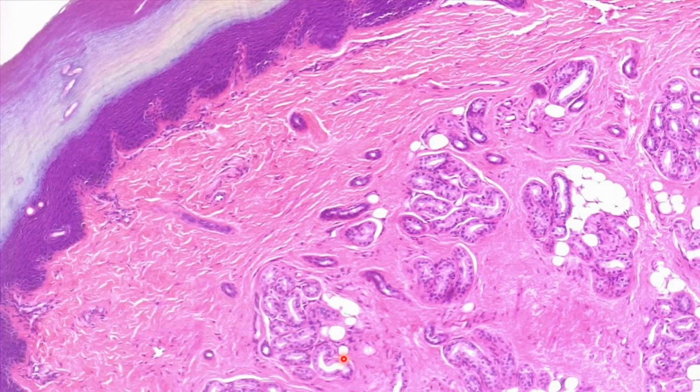Now, this is a great slide that just indicates where you have the eccrine and the apocrine glands, so the sweat glands. You can just see that there's a bunch of sweat glands surrounded here. And that's going to be different from the sebaceous glands because the sebaceous glands, again, are going to be attached to the hair follicle. So that's how you know the difference between the sweat glands and the sebaceous glands. Is it attached to a hair follicle? No, then it must be a sweat gland.